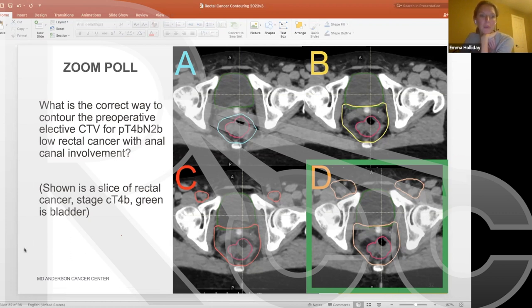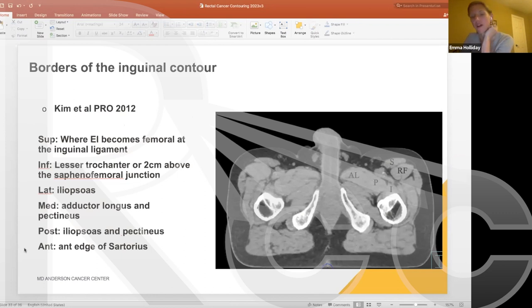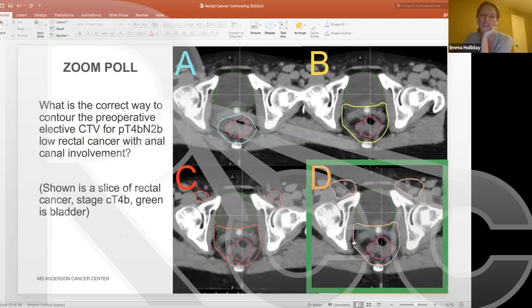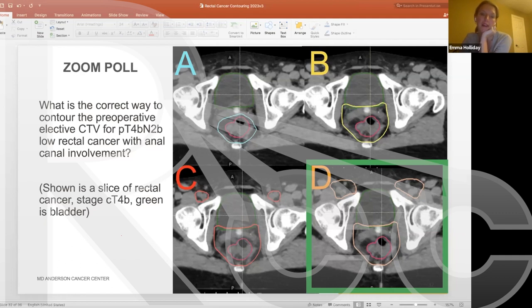A good resource for inguinal contouring is available — you may have seen it in your gynecologic oncology resources. This patient was treated supine. The structure visible at the vaginal apex is a vaginal dilator used as a spacer at simulation and every day during treatment to displace the anterior vaginal wall, preserving sexual function. Patients for whom I use this technique are simmed and treated supine, since a vaginal dilator cannot be used in the prone position.